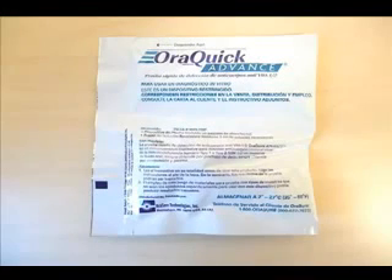The OraQuick Advance HIV 1 and 2 antibody test is a manually performed, visually read immunoassay for the qualitative detection of antibodies to HIV 1 and HIV 2 in human oral fluid. This video will demonstrate the steps to perform this rapid diagnostic test.